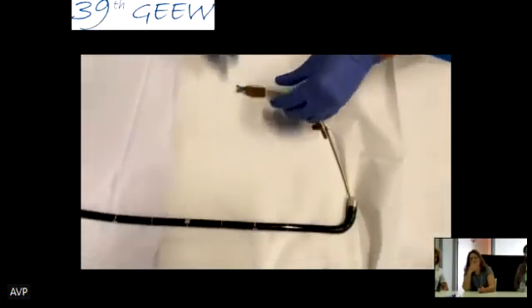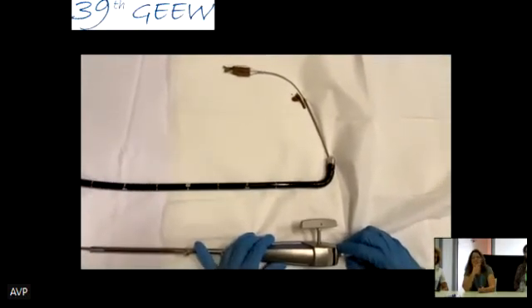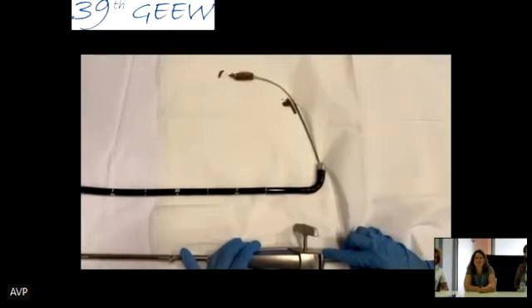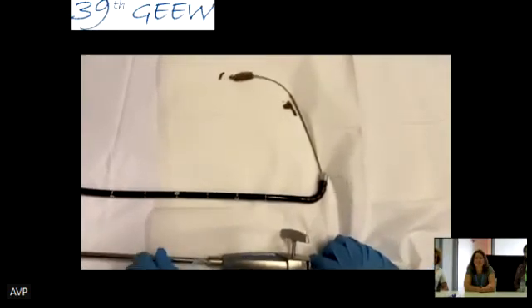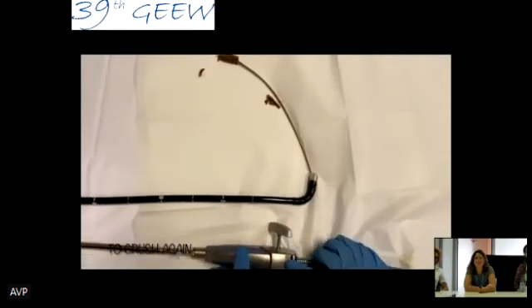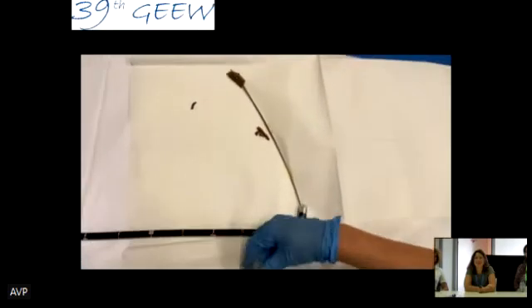It would not be so easy to put the stones like that inside in real life. When you catch it, you advance this metal sheath, put on, and you crush again. And then we can bring it back again and repeat.